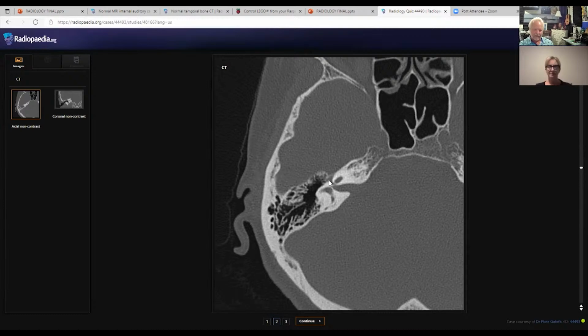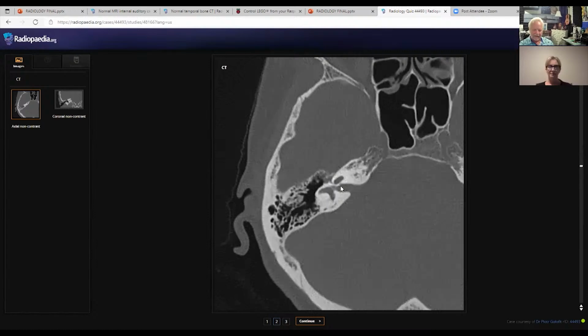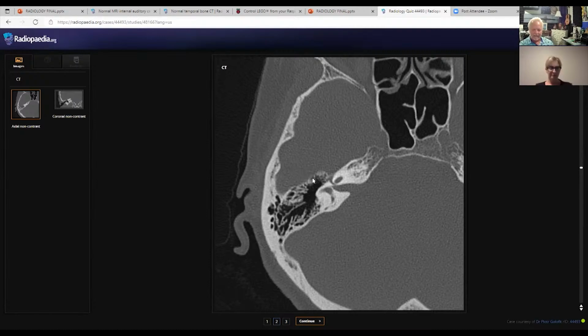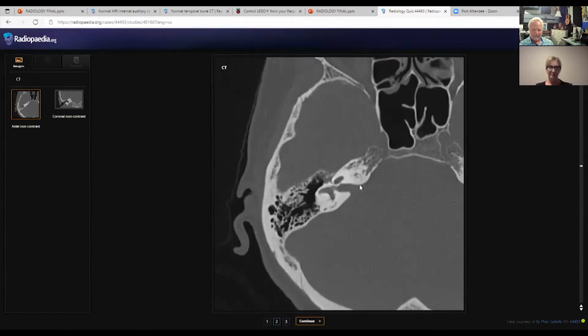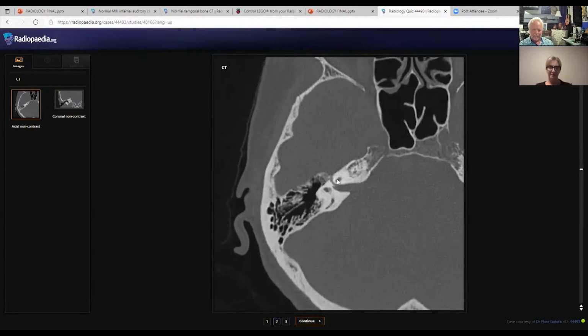And the eyes on the snail here, imagine we're cutting it the other way, vertically, and the facial nerve comes and it has a genu here. This is the anterior genu of the facial nerve. There's also a ganglion here, the geniculate ganglion, in this area. It looks like a 7 right there. And the eyes on the snail comes when the imaging is done this other way. It cuts through the nerve twice right there. And here's the cochlea, see? So you can see that just above the cochlea, because of the geniculate ganglion, it looks like an eyes on the snail.